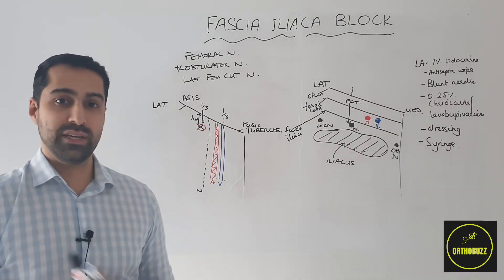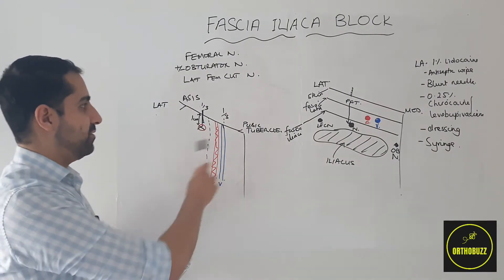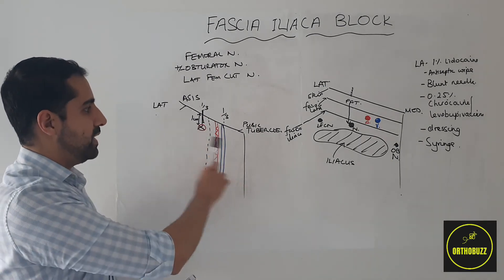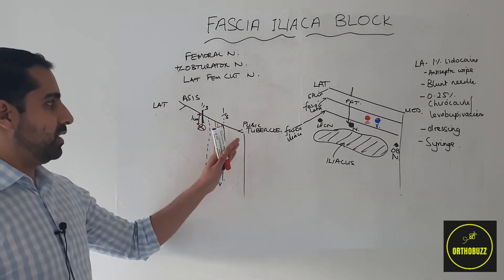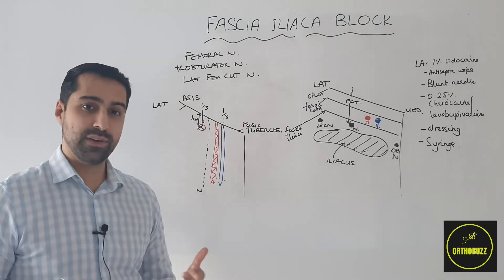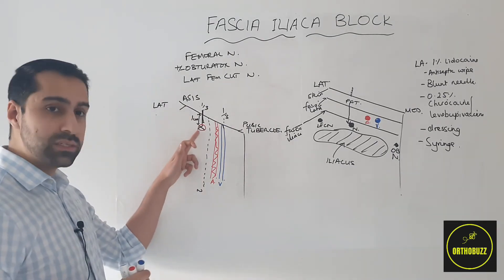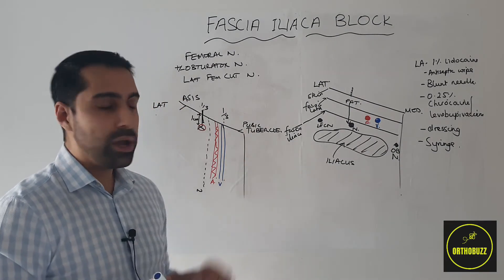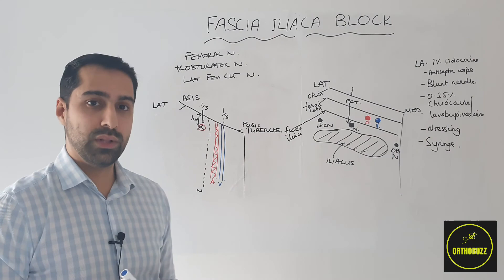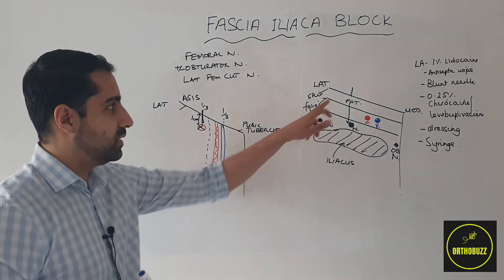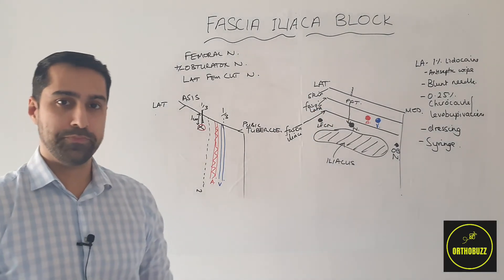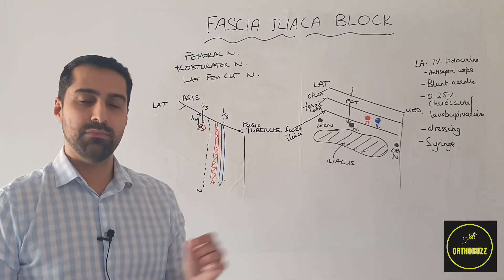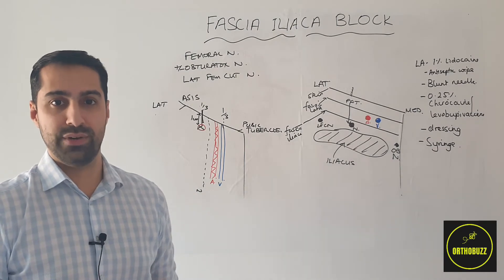The first step is to identify our landmarks — the one-third to two-third lateral to medial boundary between the anterior superior iliac spine and the pubic tubercle — and then go one centimetre distal. Once identified, we place an antiseptic wipe over that area, then inject local anaesthetic lidocaine just into the skin layer to numb the area. Wait two to three minutes for that to work, and this also marks the injection site.